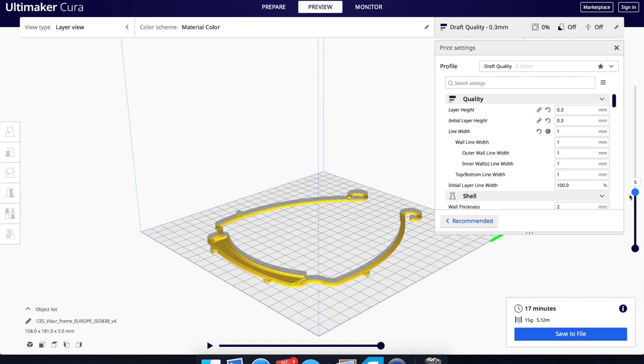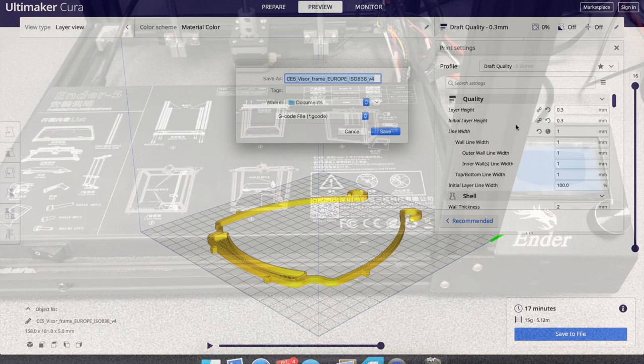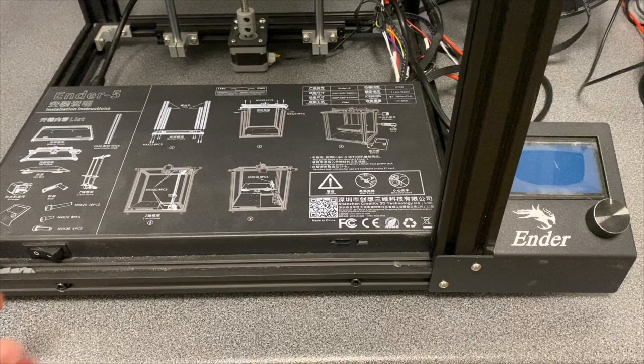First, a 3D model of the face shield frame is uploaded into slicing software. This program translates the 3D model into a set of directional instructions which allows the printer to create the face shield. The file is then exported onto a micro SD card. This is inserted into the printer.